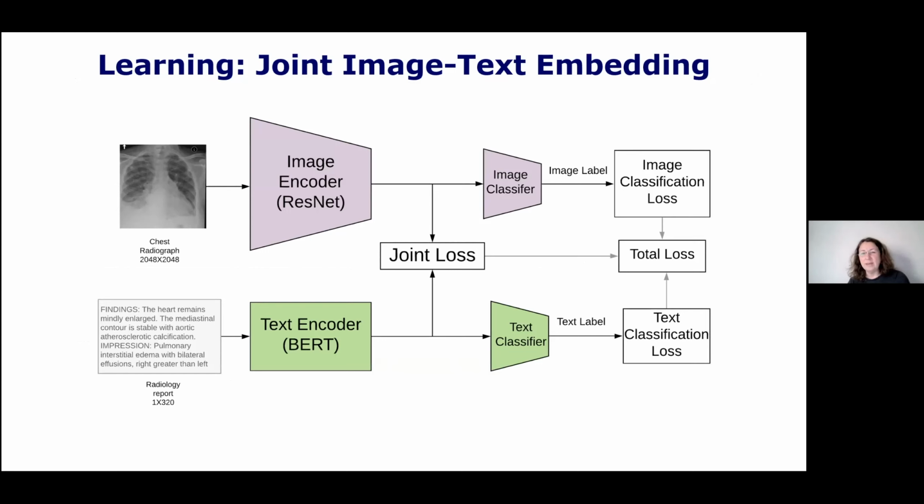One of them is that this joint loss ties the two representations together. And it turns out that classifying radiology reports is a much easier task than classifying images. To give you a sense of performance, our accuracy in classifying images without doing anything sophisticated with the baseline model is about 75%, whereas the radiology reports can be classified with as much as 90% accuracy.